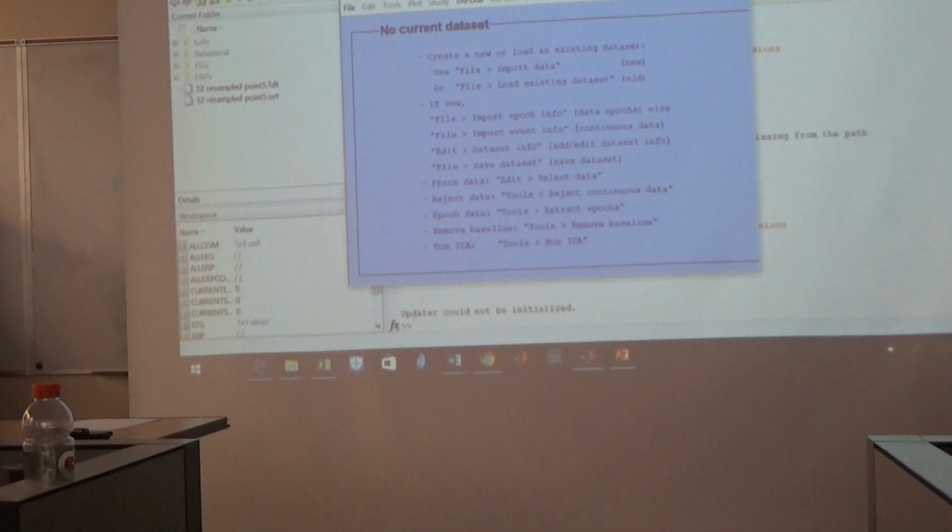My path isn't set right. It's not right because hers looks like this too. So, what we do, you want to say the path, right? So all you do is go add your subfolders. And you're going to navigate to wherever your EEGLab is.